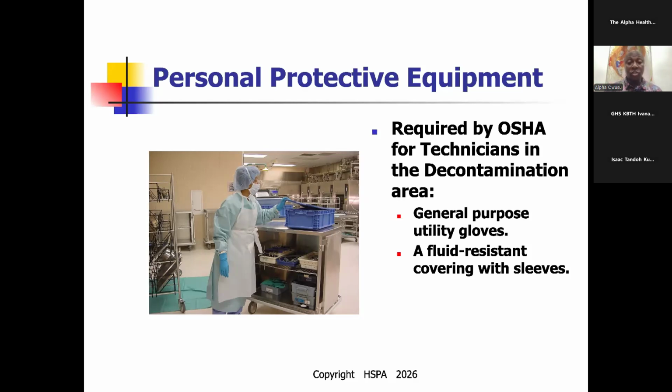Some of these solutions, when they come in contact with your body, give you burns. And the water that is mixed with contaminated bacteria from the patient, when it splashes on your attire, should not penetrate. Should it penetrate, you can get infection. Blood-borne disease, airborne disease, very, very important.